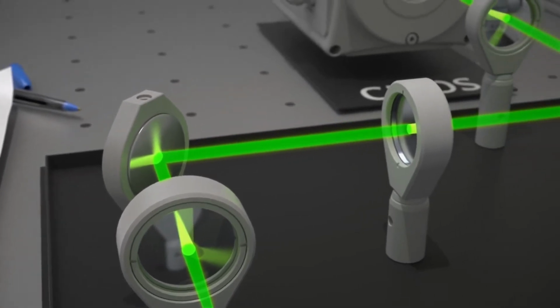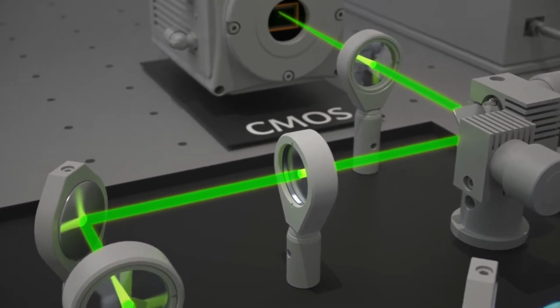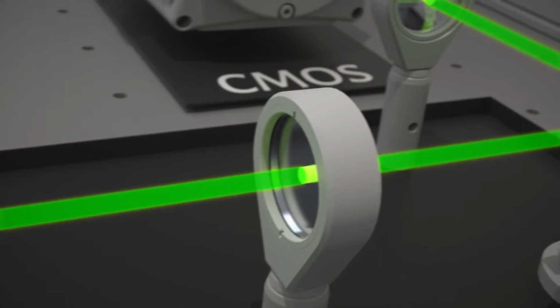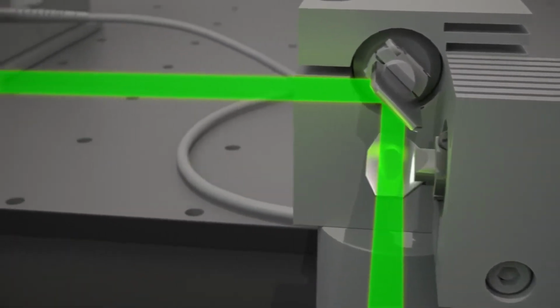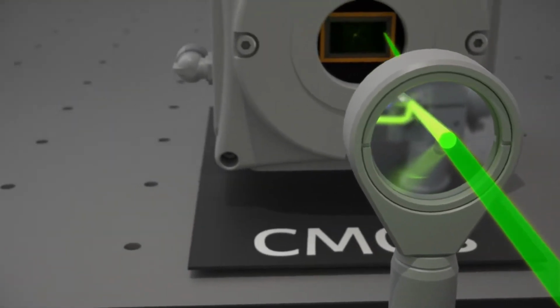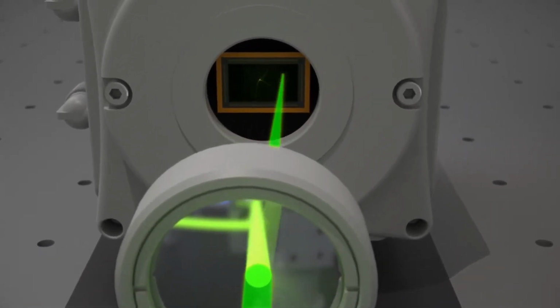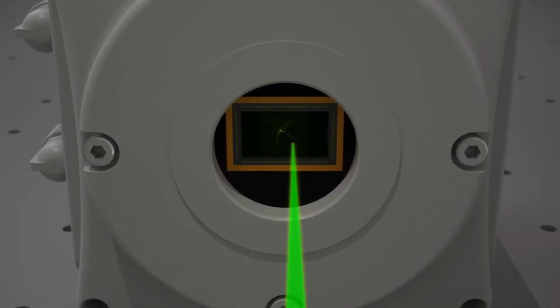I guess Trios uses liquid lens technology to accurately control the liquid lens using voltage to control the depth of focus. Although confocal technology is difficult to achieve, its advantages are also very obvious. First of all, if you can accurately control the depth of focus, X, Y-axis accuracy, then the scanning accuracy is very high. Secondly, because the focal depth can be infinite in theory, the scanning depth can also be infinite, and it is easy to scan high objects such as scanning rods.